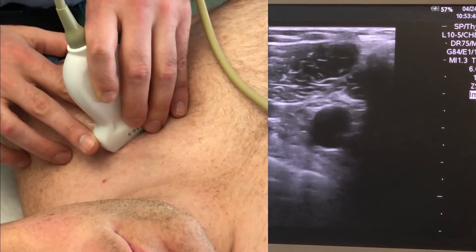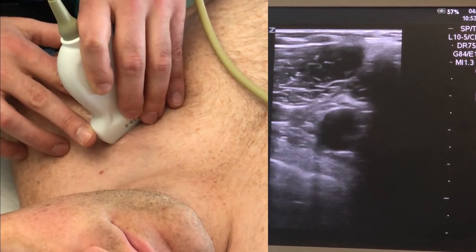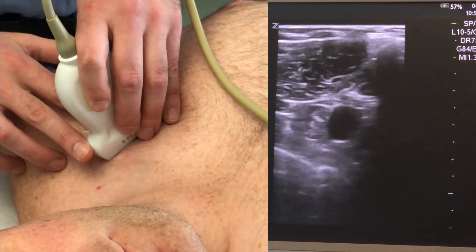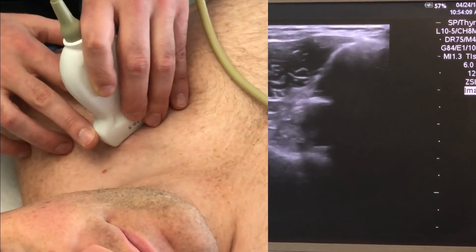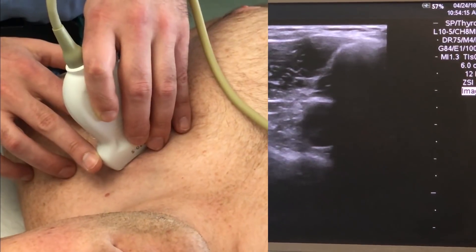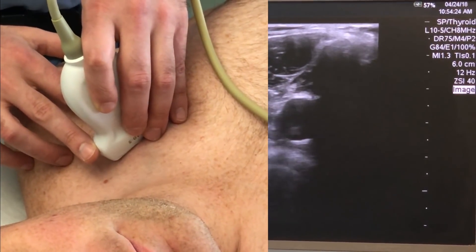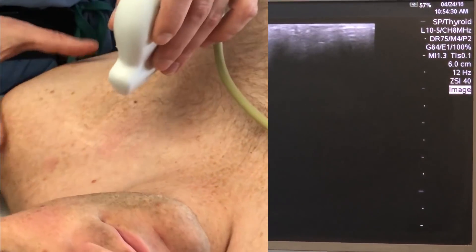If we go more medial, the vein gets a bit bigger. We're still dealing with lung tissue behind it. One of the trickiest things here is to distinguish between bone and lung tissue. If you hold the probe really still, you can see the lung tissue is clearly moving. Moving more medial, you can get a sense that the lung tissue actually transitions to first rib. The vein is getting bigger, so things are getting better to cannulate. But then you can see the clavicle is essentially encroaching on our view, making it hard to see the vein with the first rib underneath without getting blocked by the clavicle.